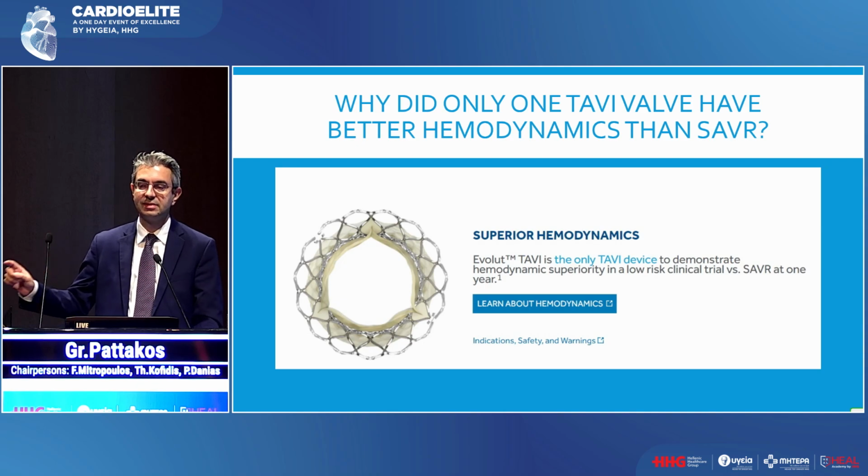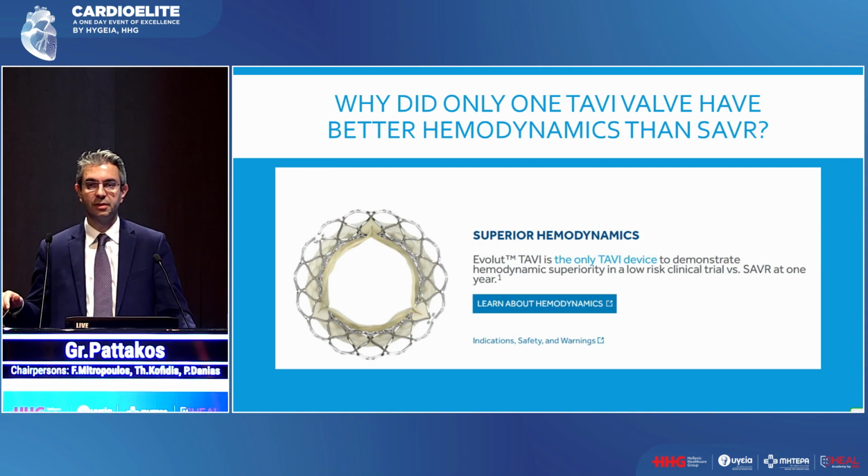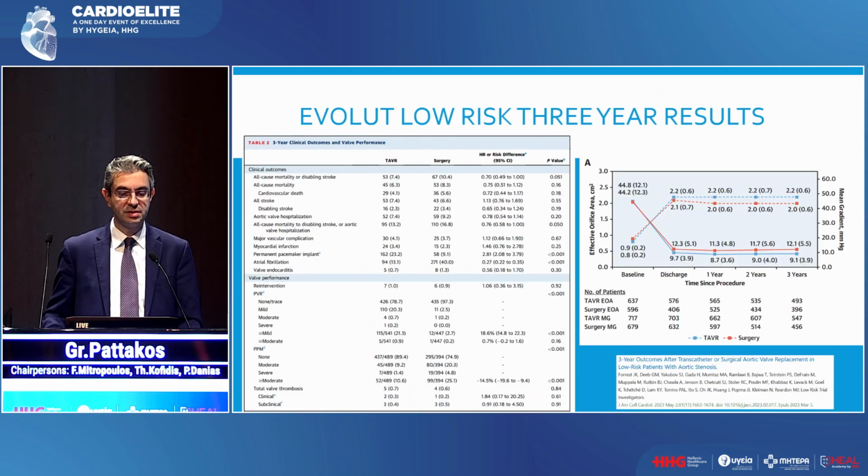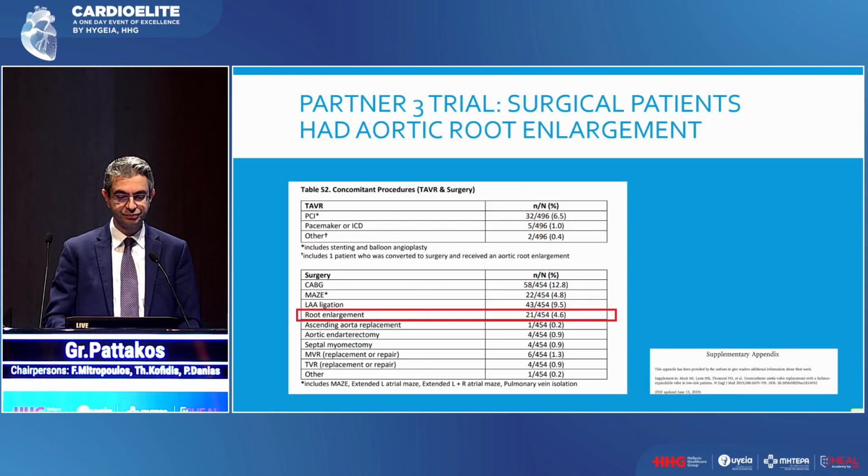And when you look at this, it's interesting, the marketing that the transcatheter valve companies have, and our friends at Medtronic, they have an advertisement that says only one TAVI device showed superior hemodynamic performance to surgical valves. What's the reason for this? You see this in the Evolut Low Risk trial at 3 years.